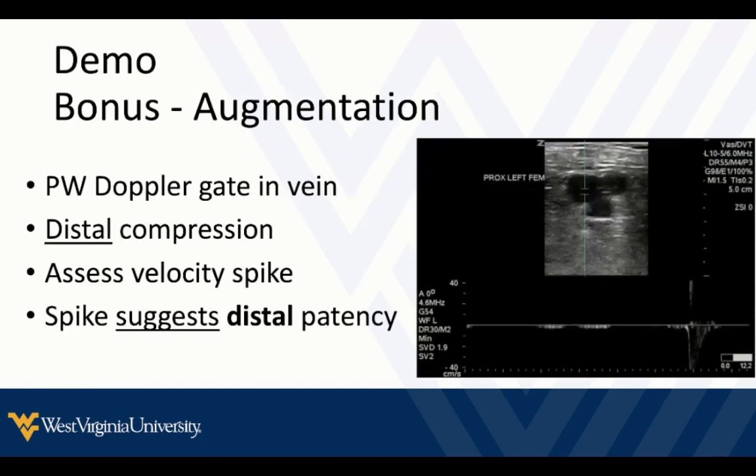Say we find the femoral vein and it seems like it collapses, but we still have a high clinical suspicion, or maybe it's difficult to collapse because the patient has a lot of edema, pain, or there's some other reason. They're very obese or they're sitting upright because they're uncomfortable lying flat. Sometimes there are reasons it's hard to compress, but we're still not sure it's a real finding.